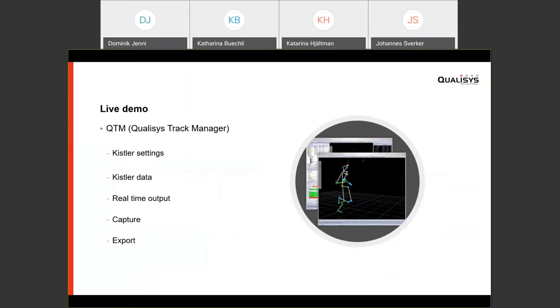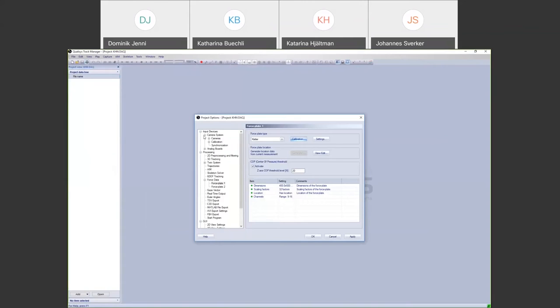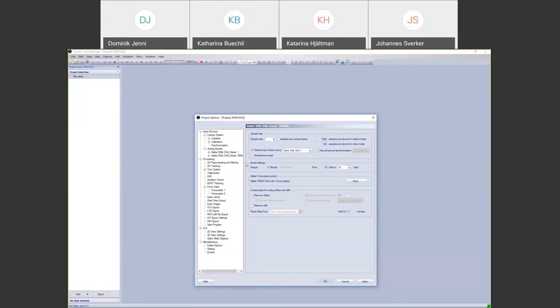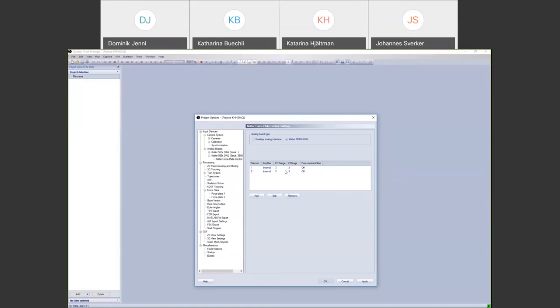In QTM, to set up the Kistler plate, you first add the Kistler DAQ. You select the sample rate — since it's synchronized by frame, you multiply by a factor, so for example five times 200 Hz gives 1000 Hz. You then define how many plates you're using, which activates the corresponding channels on the Kistler DAQ. In this case there are two plates, and you can set the measurement range for each plate.